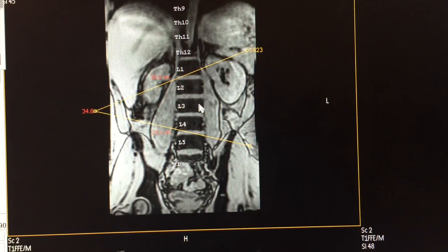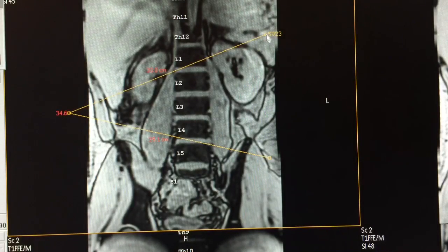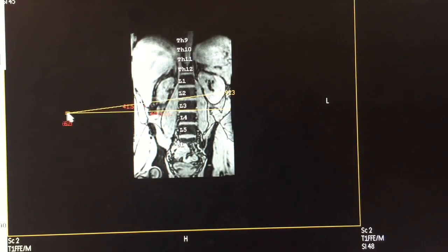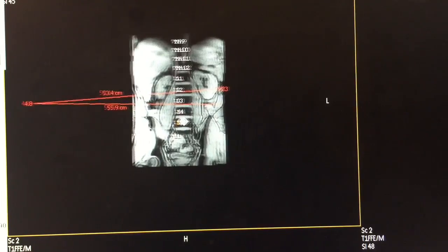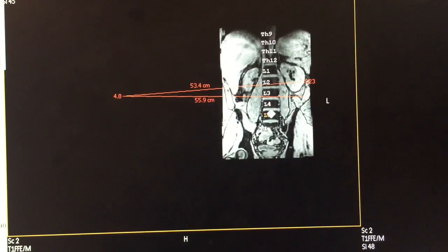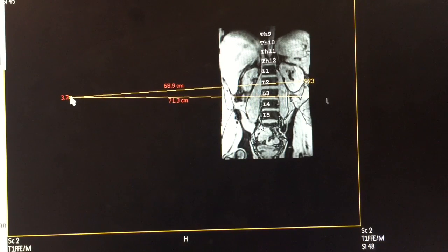The challenge here is that the image has to be zoomed out a lot. Because the angle is very narrow — less than 11 degrees — we are forced to extend the lines further away. You can also move left to right by pushing the right and middle mouse buttons, giving you more space to extend the lines if needed to measure accurately.